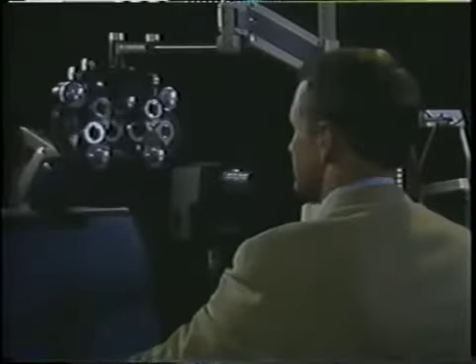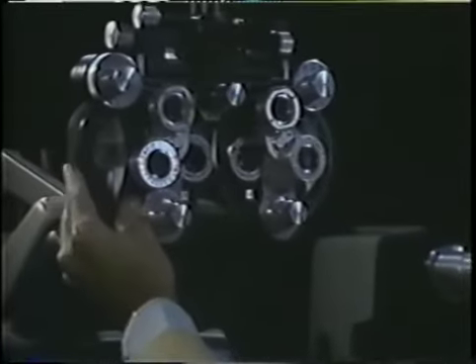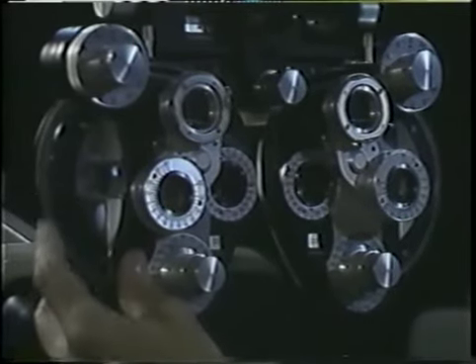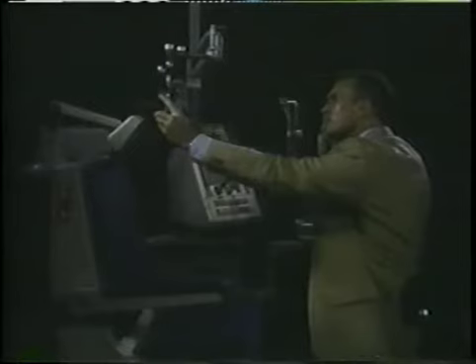Against movement tells us, of course, that we need to change sphere back in the minus direction, to dial up on the phoropter to get back to neutralization. Remember, with movement tells you to change sphere in the plus direction, to dial down on the phoropter. Against movement tells you to change sphere in the minus direction, to dial up on the phoropter. It's really very straightforward.